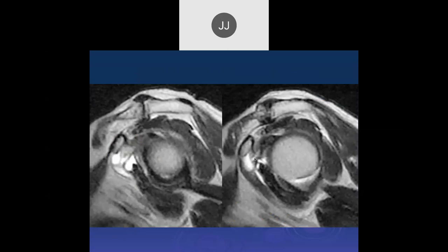Here is fluid in the joint space, in the subscapularis bursa, which is really just a component of the joint space. There's fluid coming down from the subacromial/subdeltoid bursa into the subcoracoid bursa, which is anterior to the body of the subscapularis muscle. So there's subcoracoid fluid visible here.